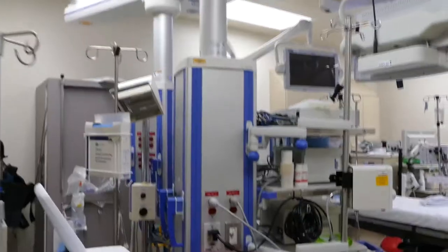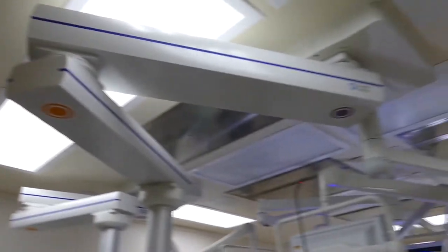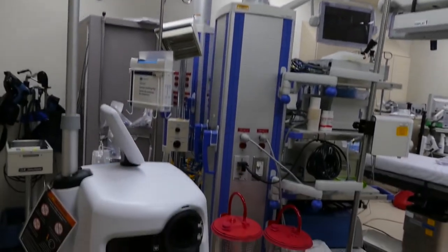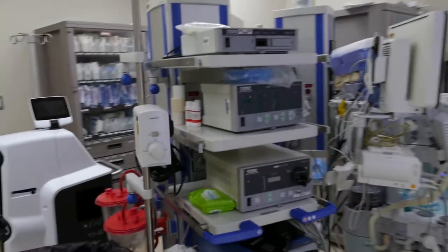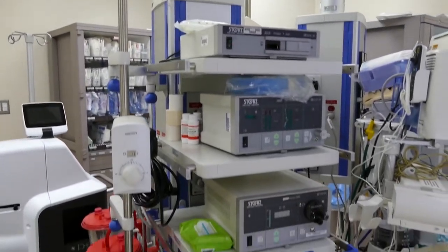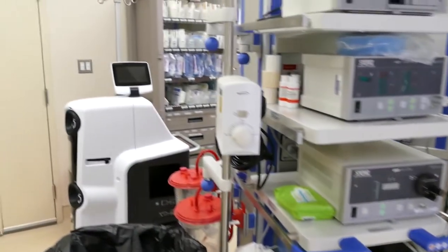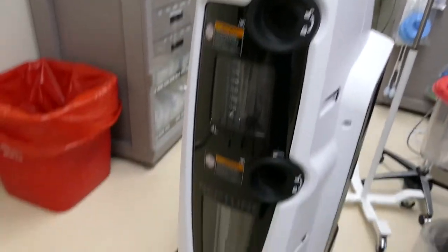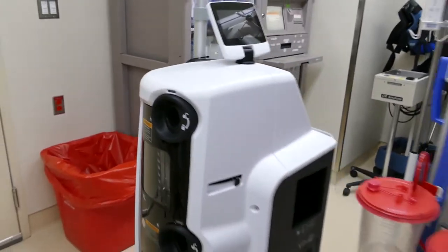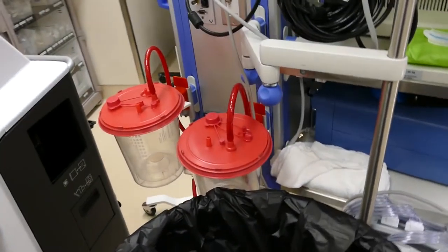As the doctor's calling out stats, she's entering it into the patient's record. This operating room has got one equipment boom — a lot of the better rooms have two, one on each side of the bed. On the equipment boom you'll see a camera box, an insufflator, a light source, and an electrosurgical unit. There's also an irrigation pump. This right here is a Neptune, which is a giant suction unit. There's a little manifold that pops in here; suction tubes connect straight to it, and reservoirs in the top and bottom contain the hazardous material — a much cleaner way of doing it than the old containers.